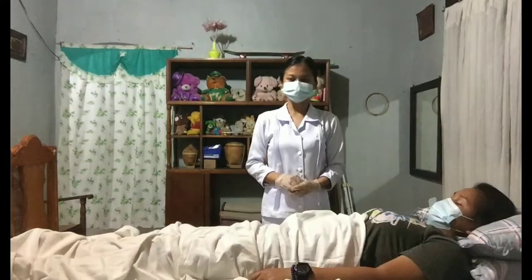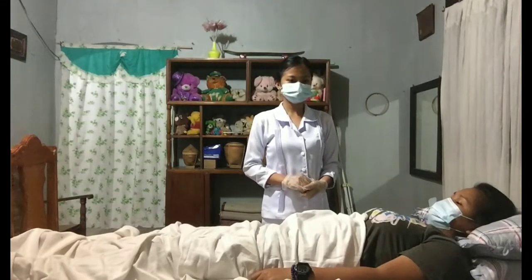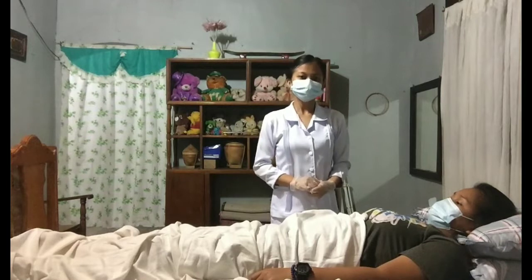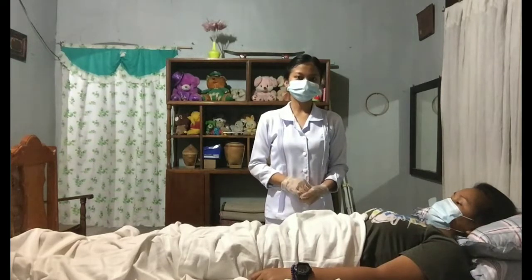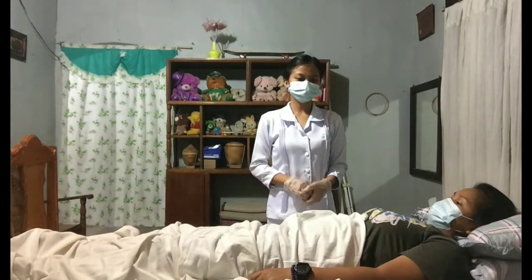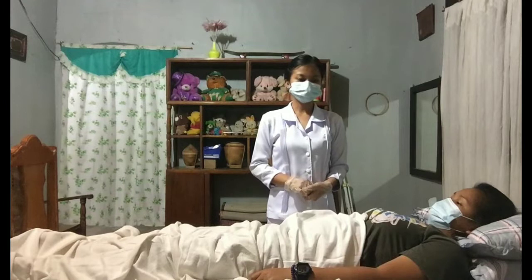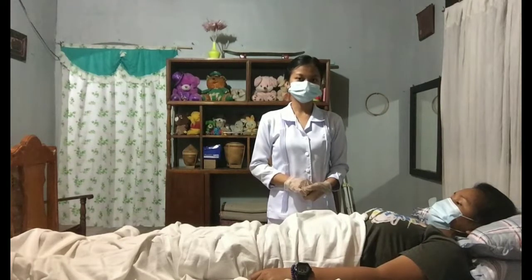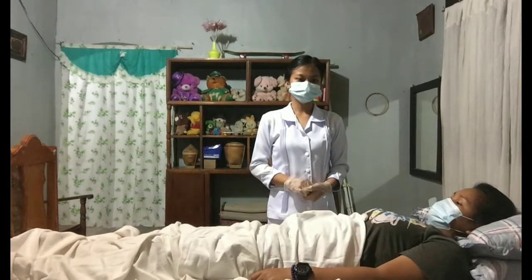Next is assisting a client to a sitting position on the edge of the bed. The first step is to place the bed in the lowest position, then raise the head of the bed slowly and as high as the client can tolerate.